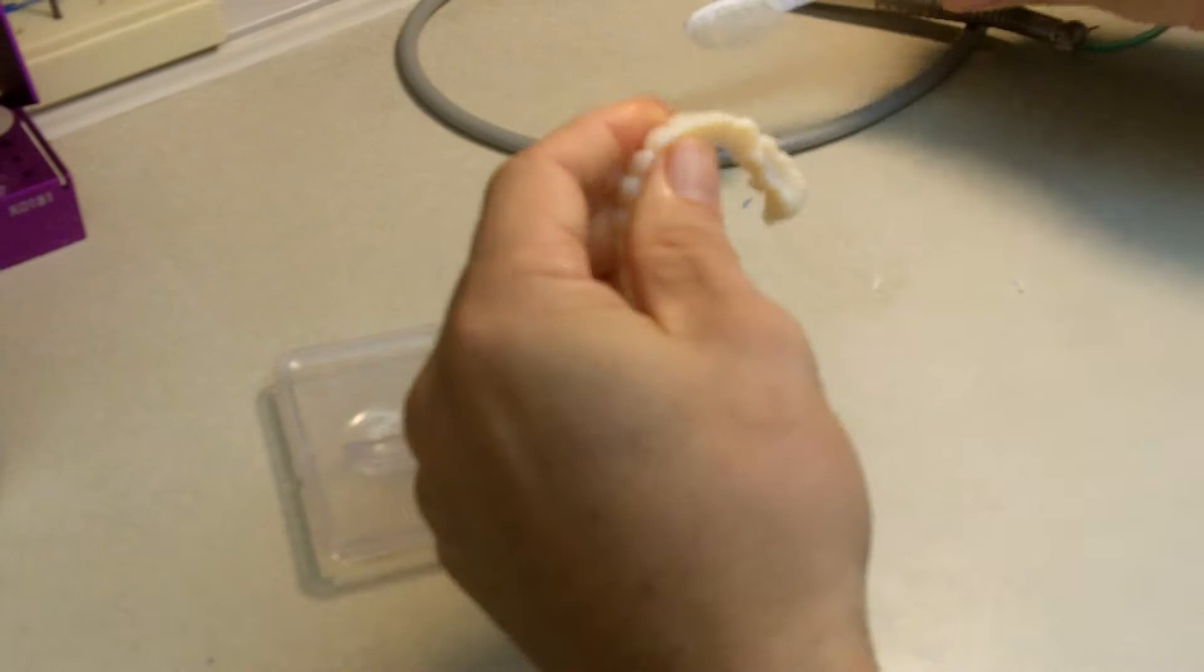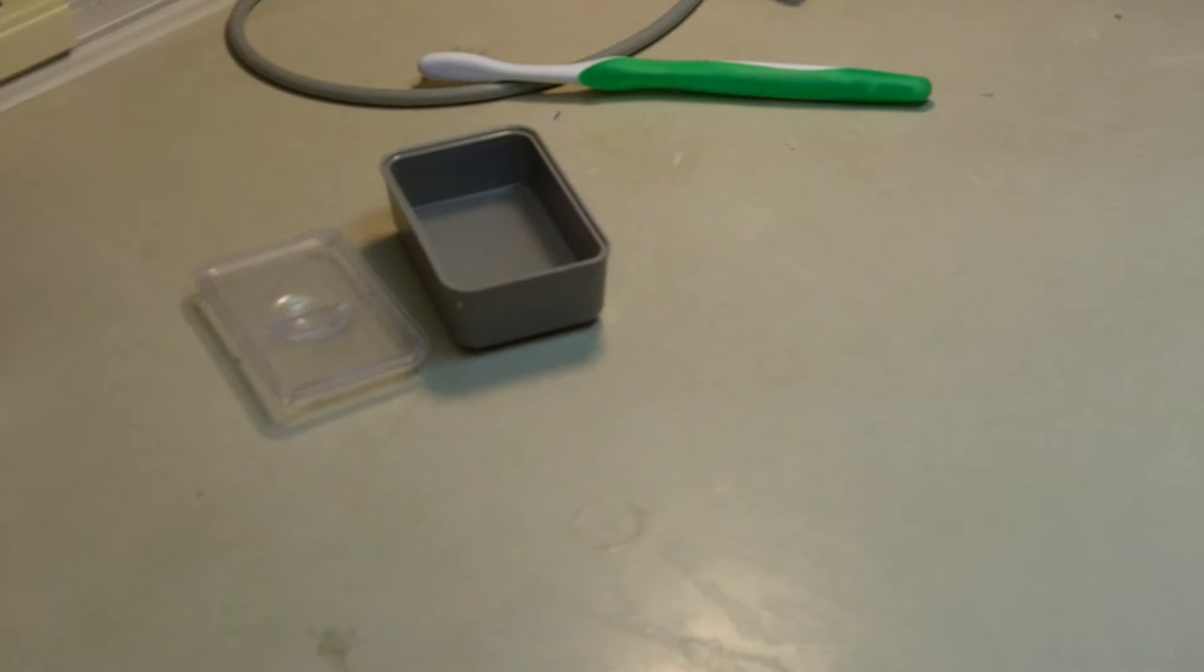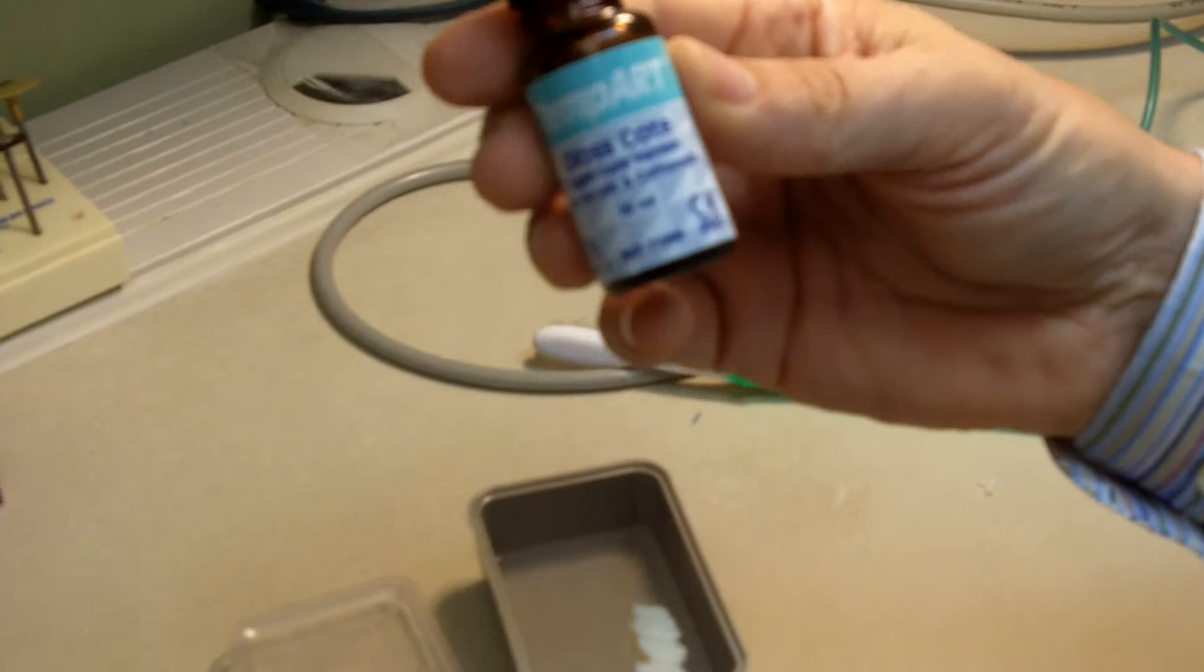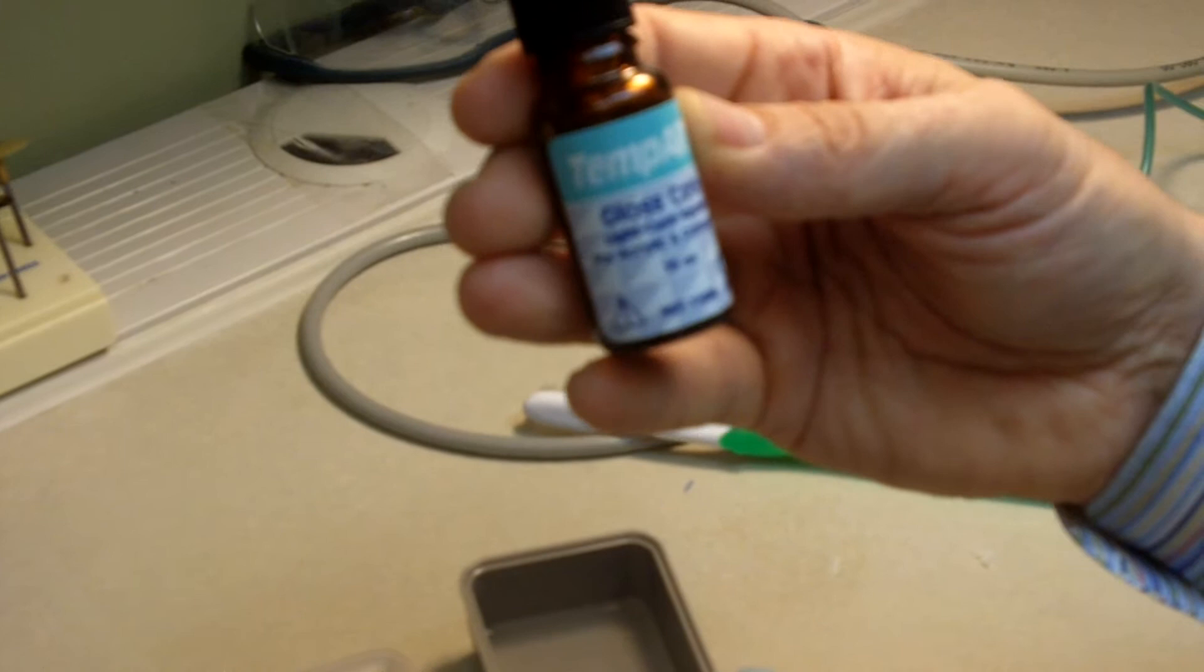And then I'm going to use Gloss Coat by TempArt. This is made by the people who make HydroCast denture material, so it's called Gloss Coat. This is a great adhesive to use.